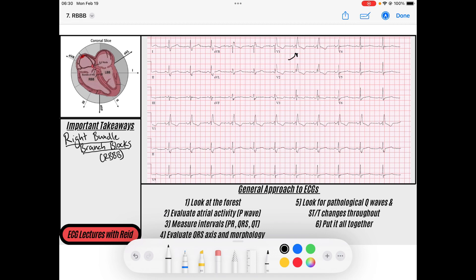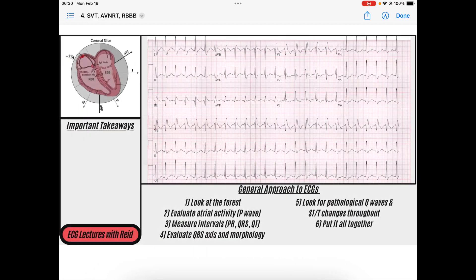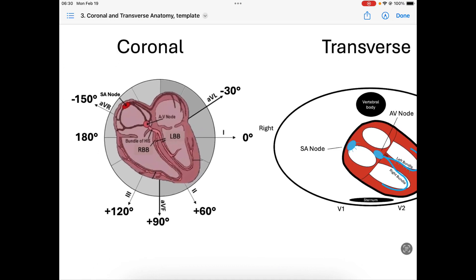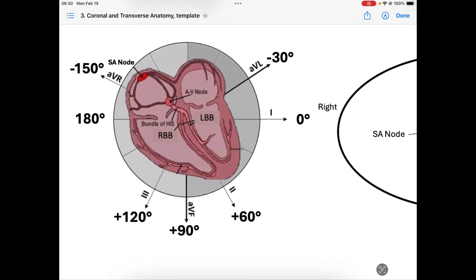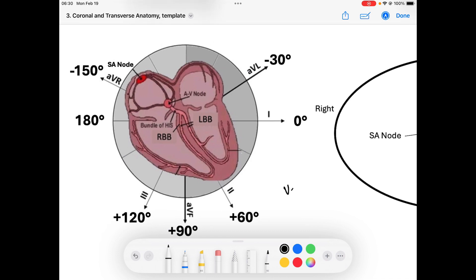Let's get started. First, what is a right bundle branch block? A right bundle branch block is a type of ventricular aberrancy. Aberrancy means that conduction within the ventricles occurs aberrantly — it doesn't occur correctly. We know that usually the AV node receives signal from the SA node.